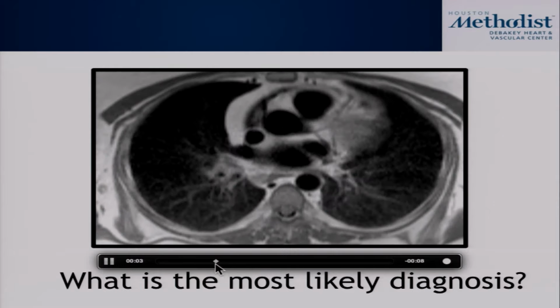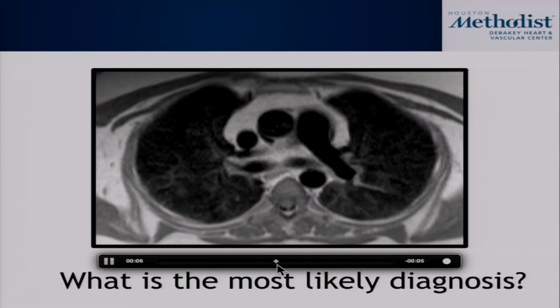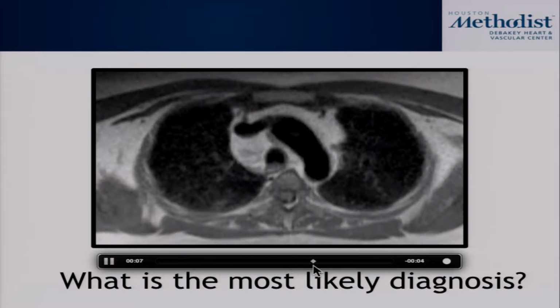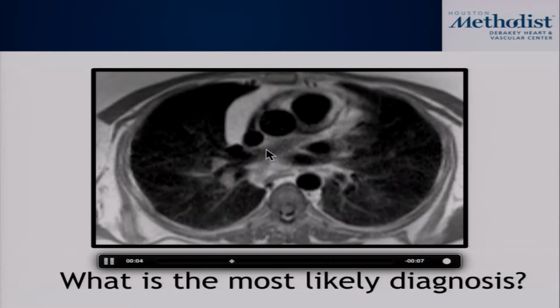Yeah, so is it a lung mass, or is it more fullness in the hilar area that you can see here? And then also if you come up to the mediastinal or the paratracheal area, you see these areas of fullness, right? This is what you'd be concerned about, adenopathy.